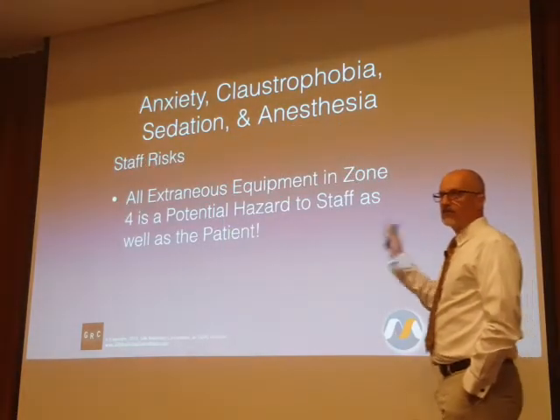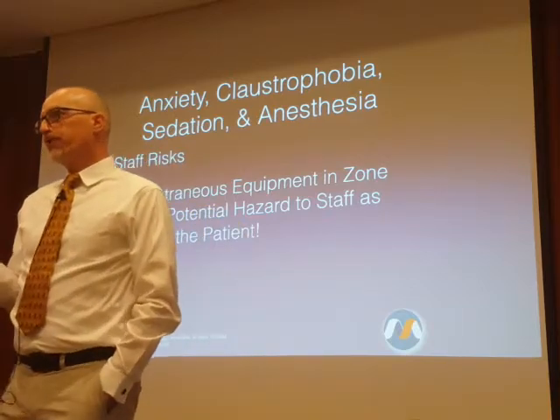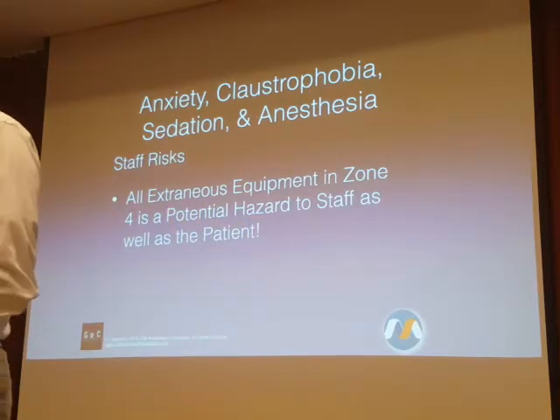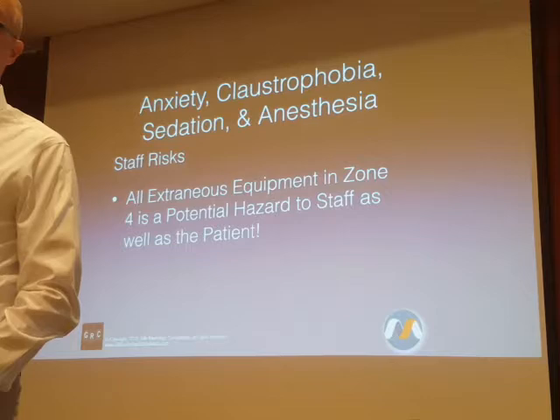With respect to staff, a significant proportion of projectile-related accidents injure radiographers or radiology nurses, in addition to striking patients.